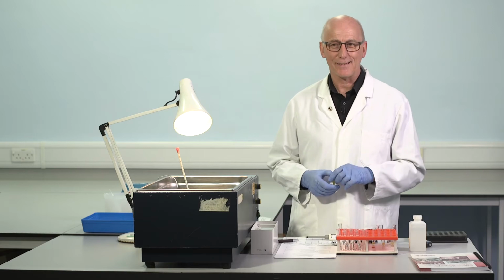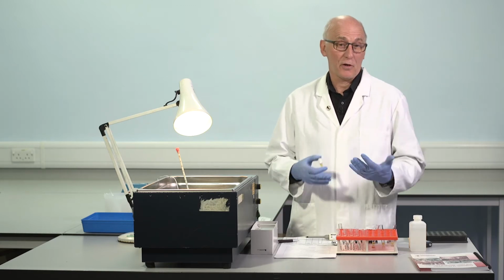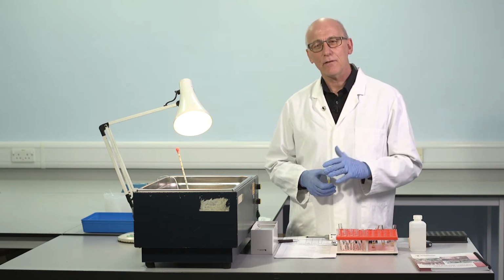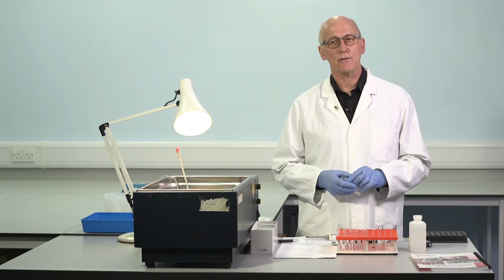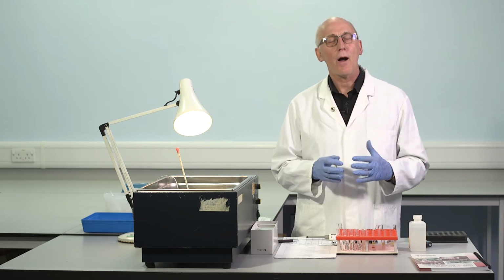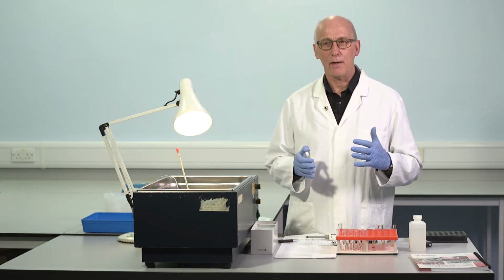Actually, that's what we do in my centre. And we do that for several reasons. The most obvious might be cost. It's cheaper. But actually, it's not even the main reason. The main reason is that we're able to prepare a control which is quite close in its properties to patient samples. What do I mean?